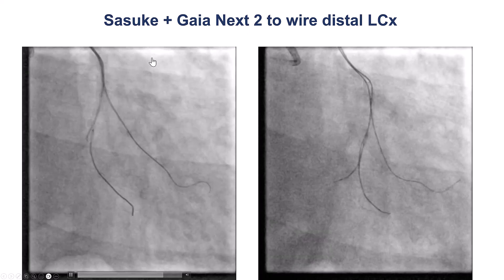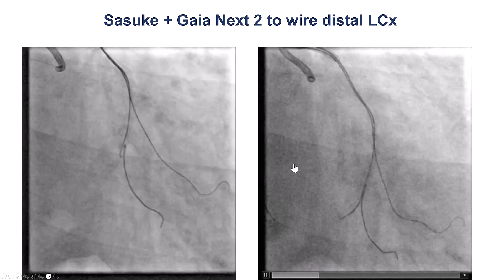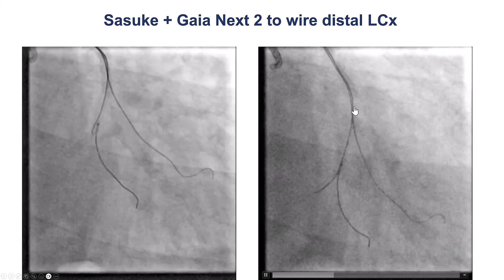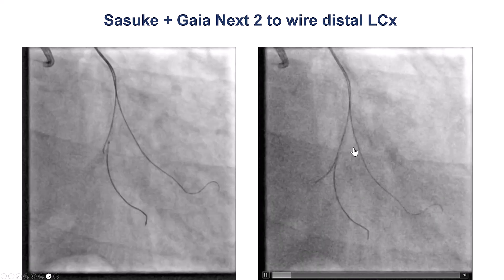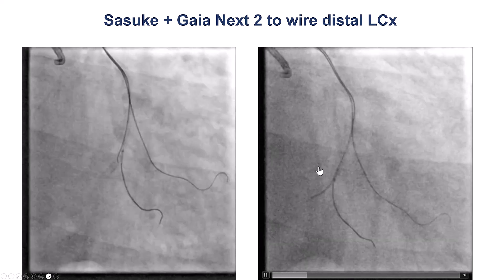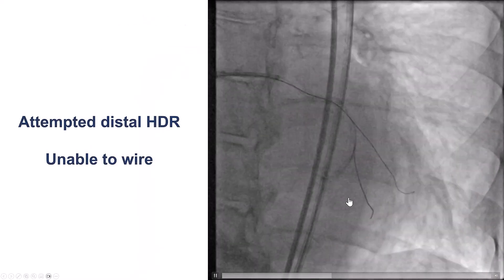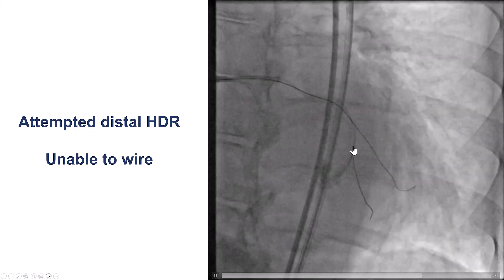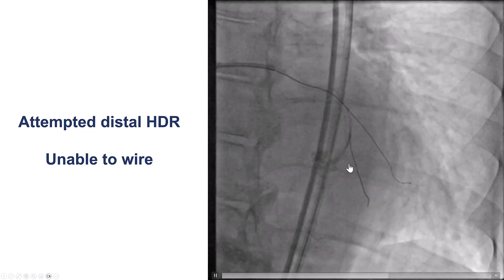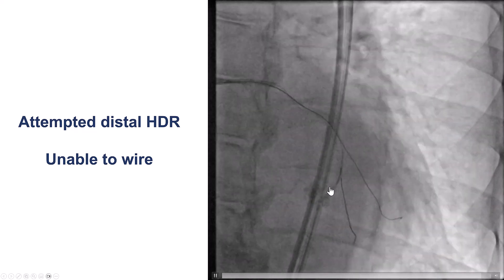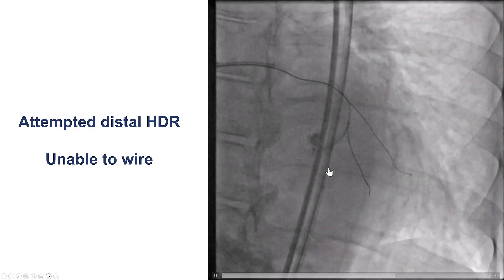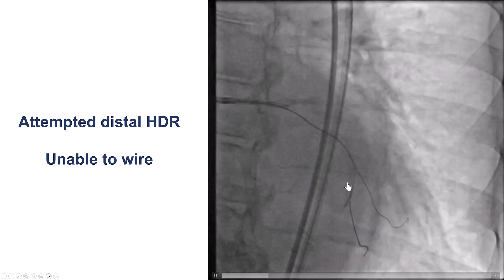After that, we switched to a microcatheter again and tried to wire into the distal circumflex. We had outflow from the first and second obtuse marginal and wanted to also get outflow in the distal circumflex. We performed HDR again — putting the microcatheter in and advancing a half cc of contrast through the tip. Unfortunately, perhaps due to previous wire passes, the contrast seemed to be staining in a broader territory than we would like.